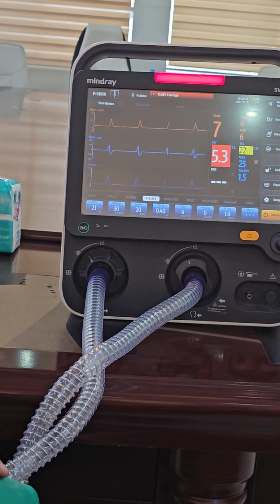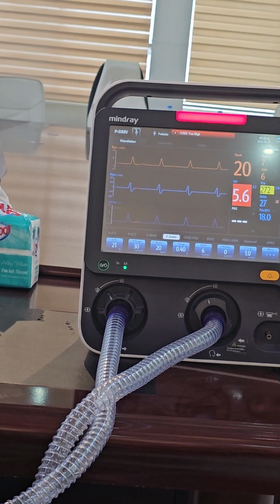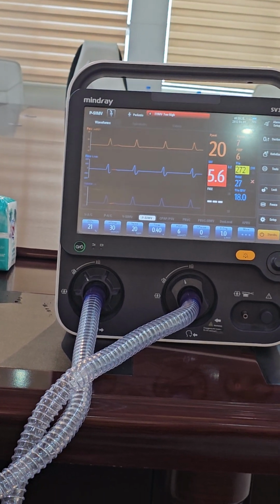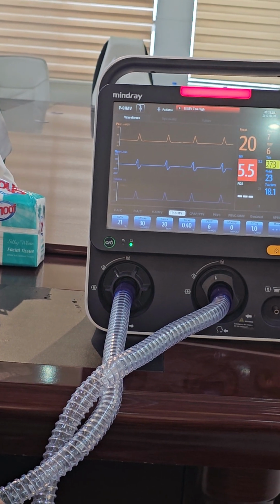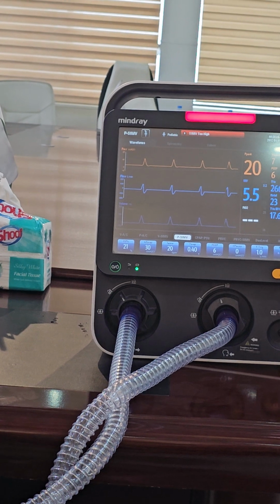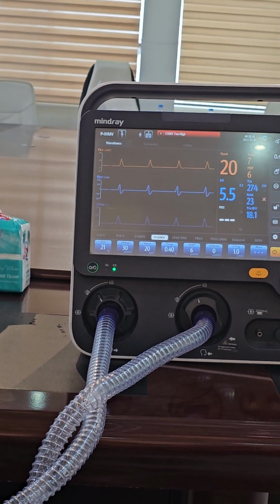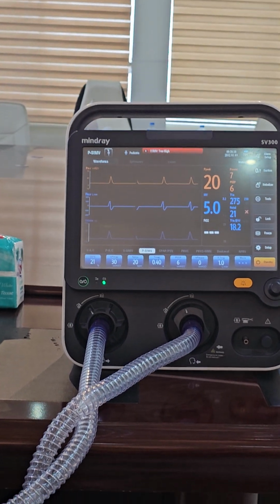Let's say the rate is 30. What is this 30? Mandatory, the control, the backup. And this is the assisted. So let's say the patient is breathing 60 times. How much will the rate be on assisted control? 60.